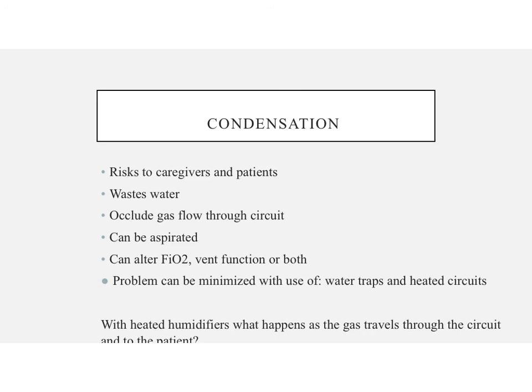It wastes water. It occludes gas flow through the circuit, so your patient's not getting the proper flow or the proper FiO2. It can be aspirated. Once a patient is receiving humidification and they have a closed circuit and they're breathing, within hours the water is considered infectious waste because it has everything that they're breathing in and out, and what is growing in their lungs is going to be in that humidity.